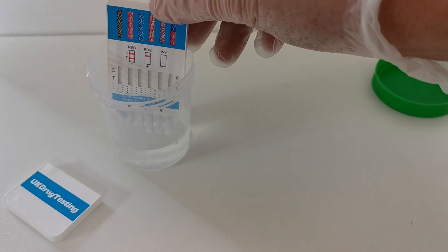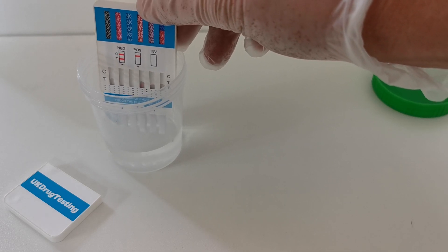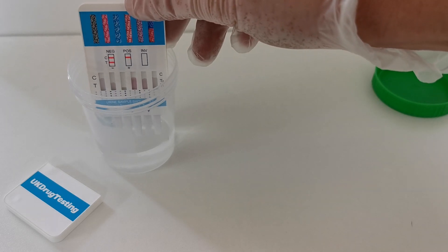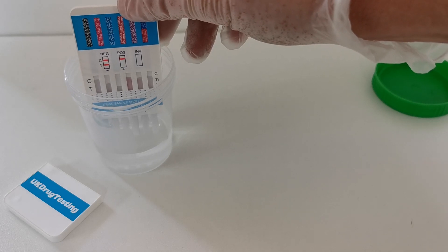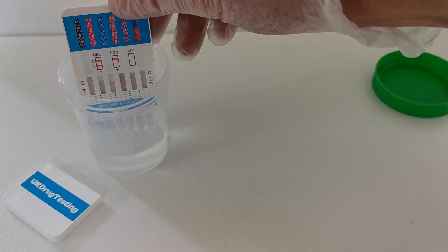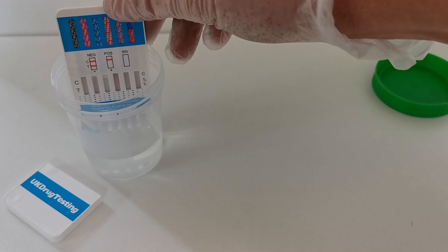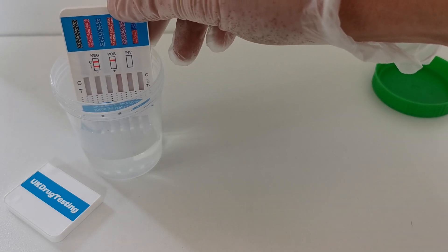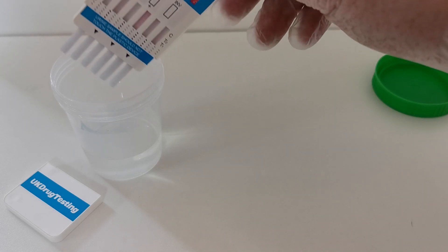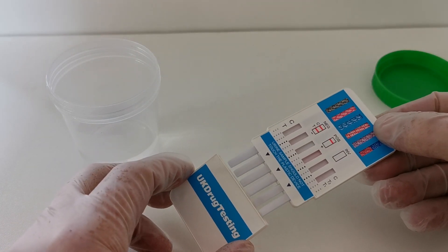The urine sample needs to be around two to three centimeters in depth and in a suitable container that is wide enough to take the drug test panel. As soon as the panel is dipped you'll see the pink dye starting to run up through the results windows, showing that the wicks are working properly and that the fluid is being absorbed. It's usually required to be dipped for between 5 and 15 seconds. As soon as you see dye going up all panels you are probably okay to remove it from the sample and replace it into its cover.